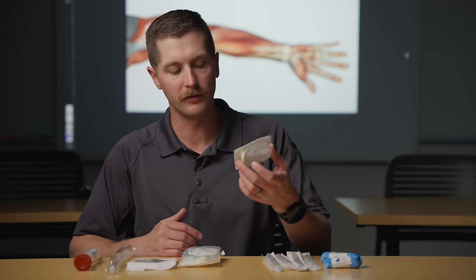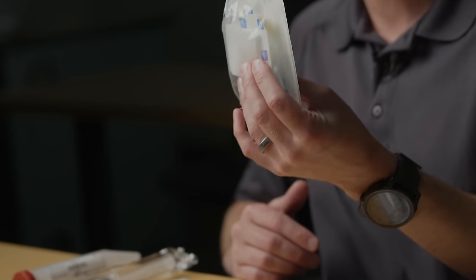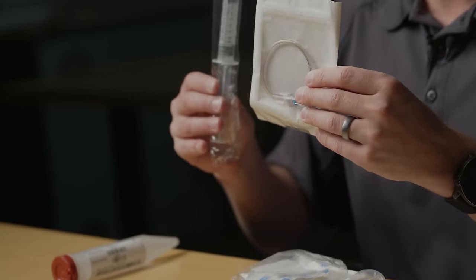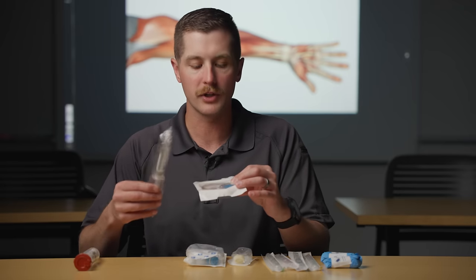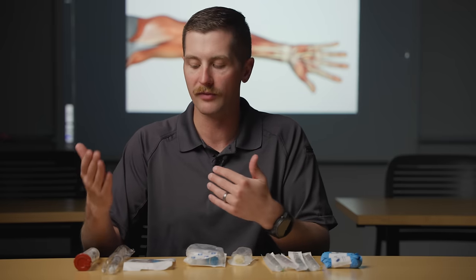We have to have some kind of alcohol prep or chlorhexidine to clean the site. We have a start kit with everything you need inside of it, and then we have a pigtail and a flush. This is what's actually going to connect to the hub of the IV catheter and we're going to flush some fluid through it. This is going to stay on their arm and gives us easy access to give medications as their care progresses.